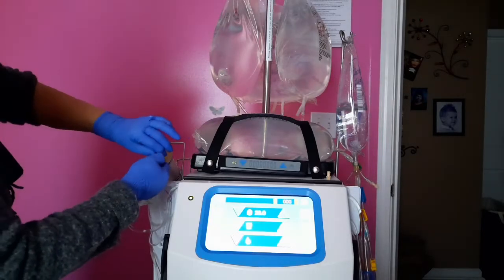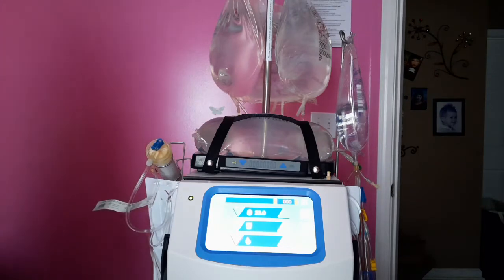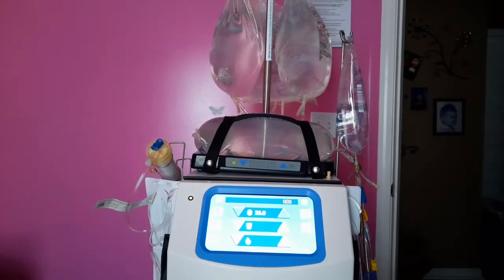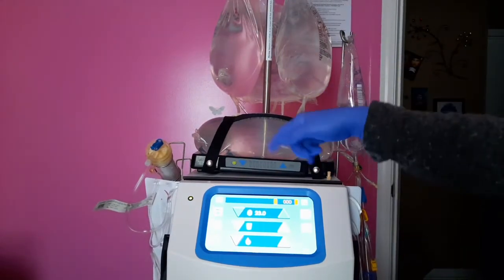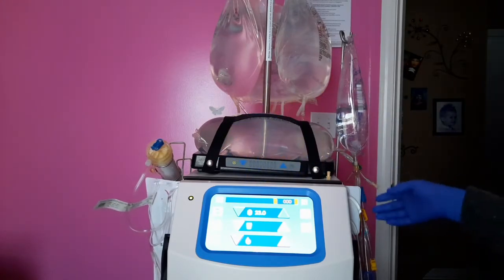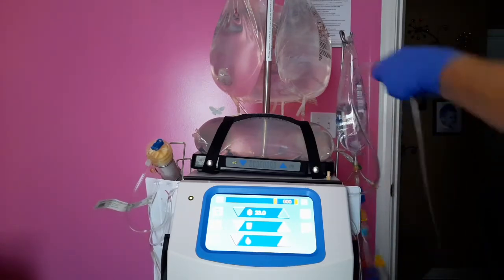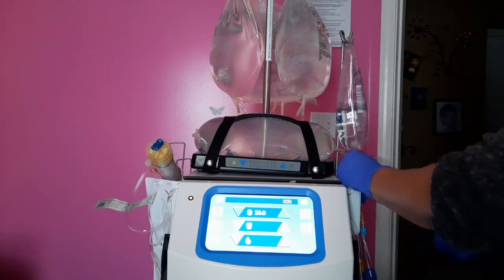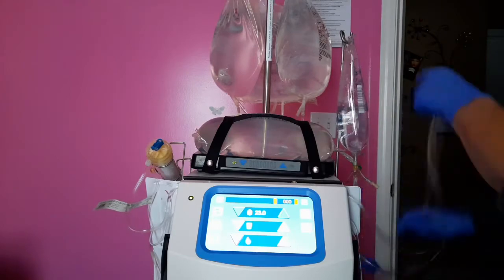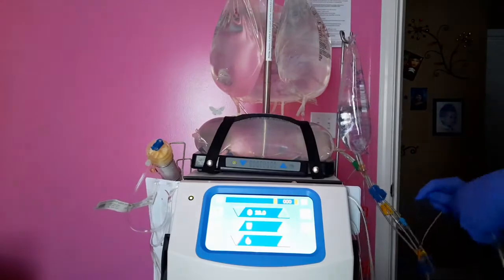So once you've primed it, that's called priming, then you want to clamp. All right? So you're done with that. And if air ever gets in there, the machine will alarm, and that's what you would need to do. Most people use a syringe. I just do that. Okay? So now we'll go back to the venous. Snap, snap. Snap, snap. All the way back up to the saline bag.